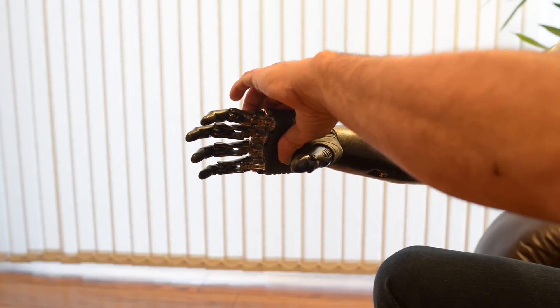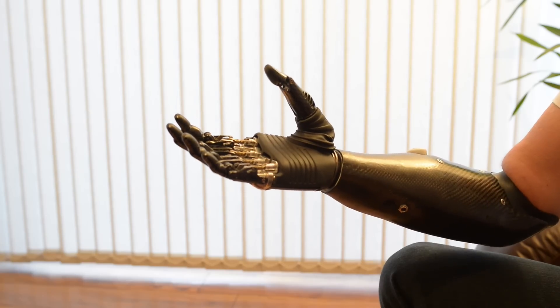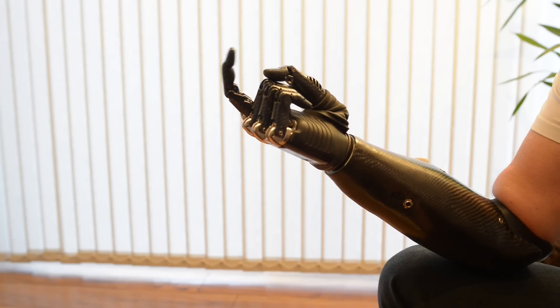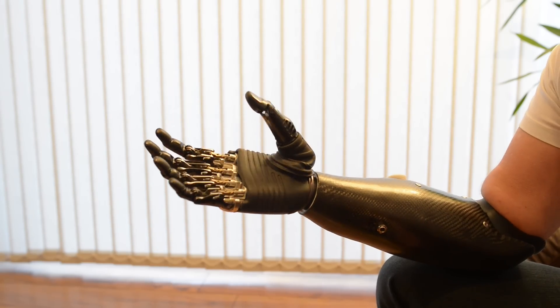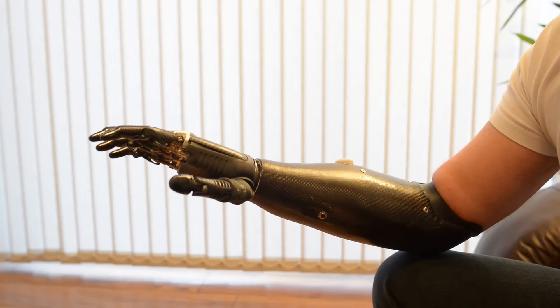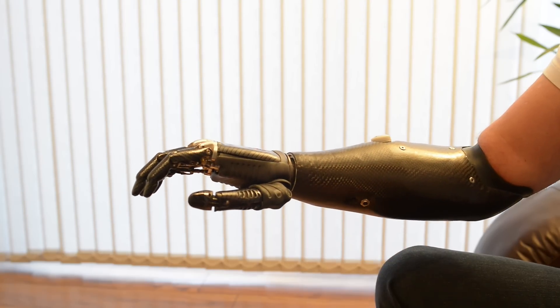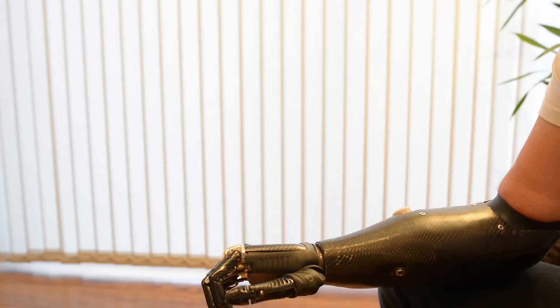Then we have this grip here. This is one that scares children and upsets my wife. This is trigger grip, but it can be adapted if you so wish — if you've got the guts. Having a relaxed grip — this is so that when you walk down the street, it just looks like a normal hand. You can close it a bit further if you want to.